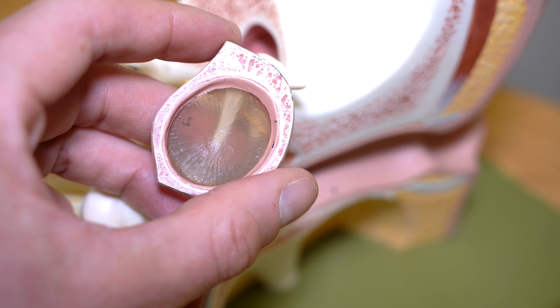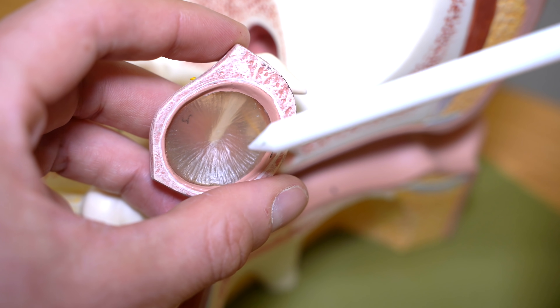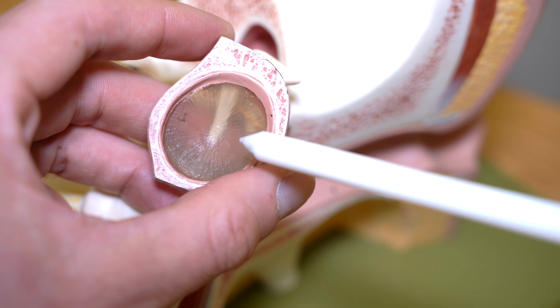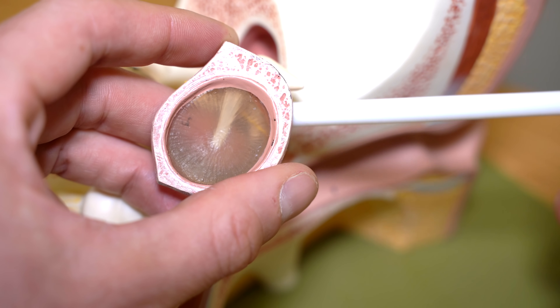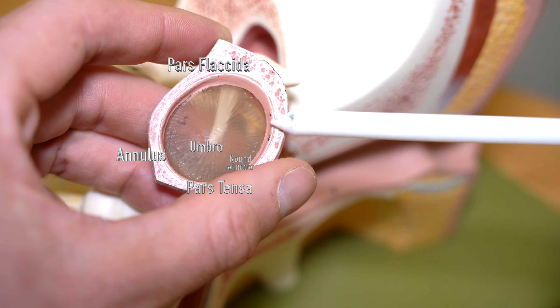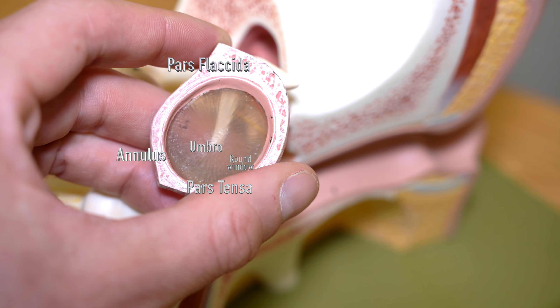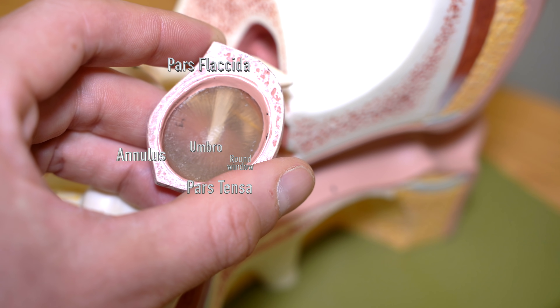There are several features we want to identify on the tympanic membrane. One is the presence of a light reflex, which we should see reflecting the light from our otoscope. We also need to be aware of the handle of the malleus, and sometimes we can see the long process of the incus just behind it. There are two sections: the pars tensa, which is the membranous area, and the pars flaccida, just at the top. This flaccid upper part is particularly important — here we may see changes from a cholesteatoma.